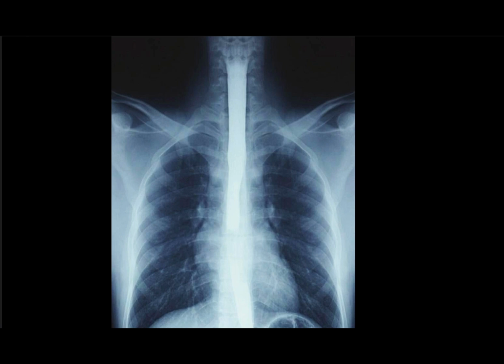In this video, we are going to identify and explore a barium swallow radiograph. Many students tend to confuse barium swallow with a barium meal because both of them use the same contrast medium, which is barium sulfate. So the key difference in both of them is that in barium swallow, you're trying to visualize the esophagus. In the barium meal, you're trying to visualize the stomach.